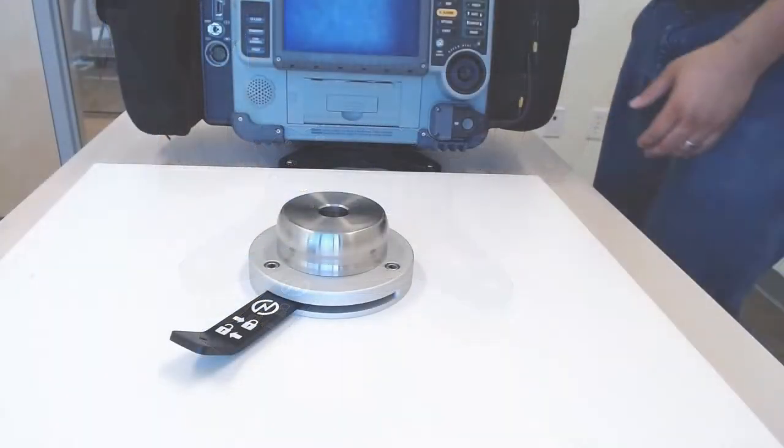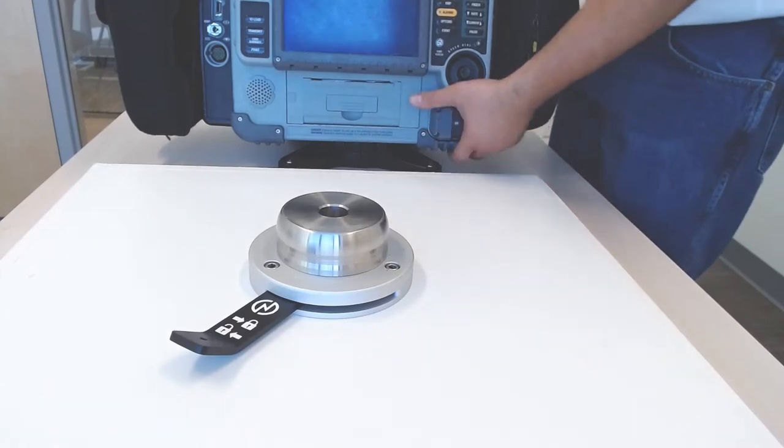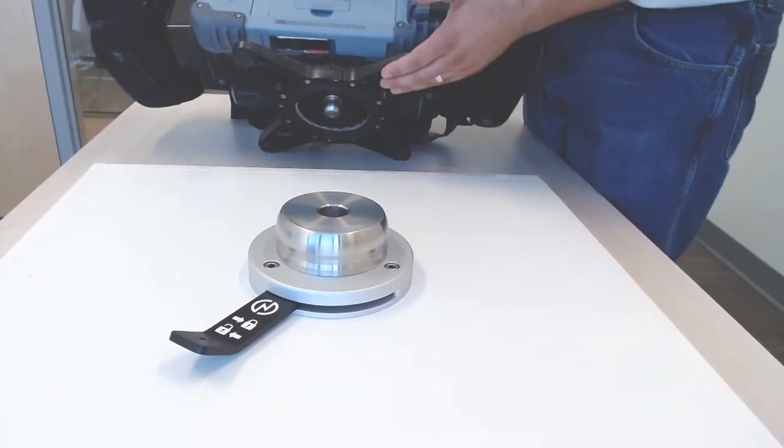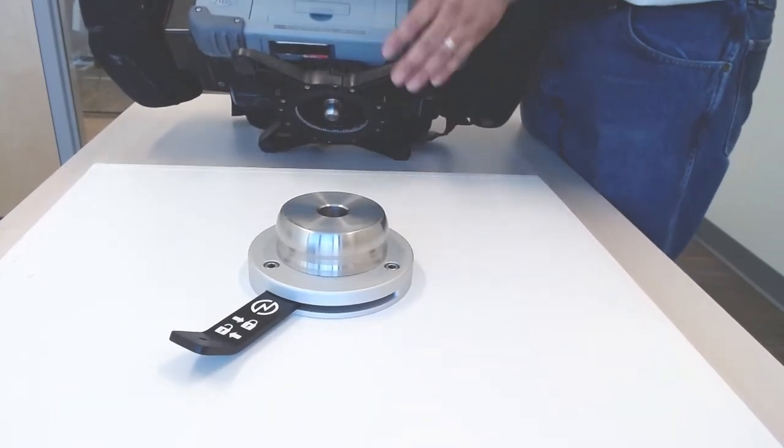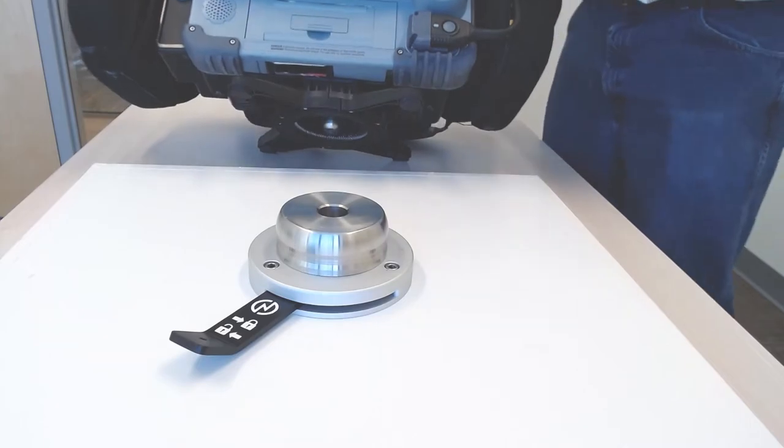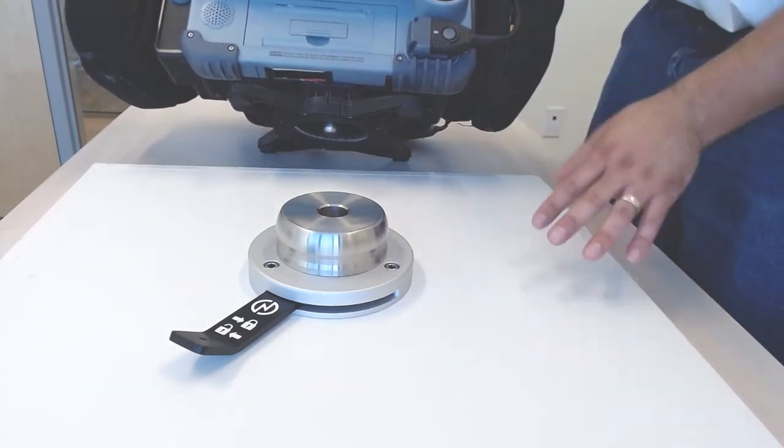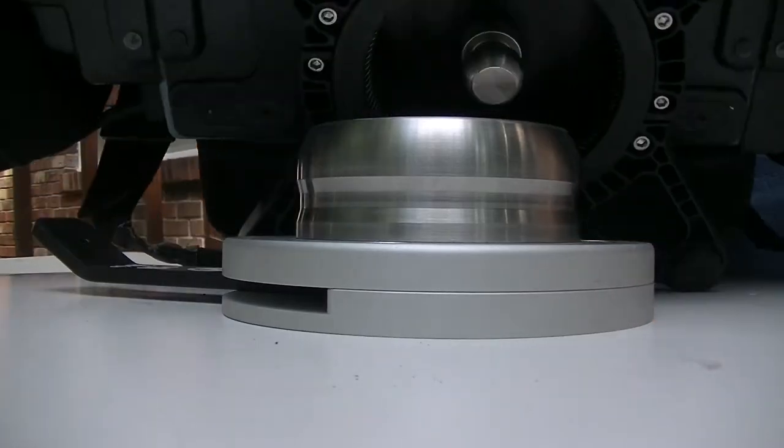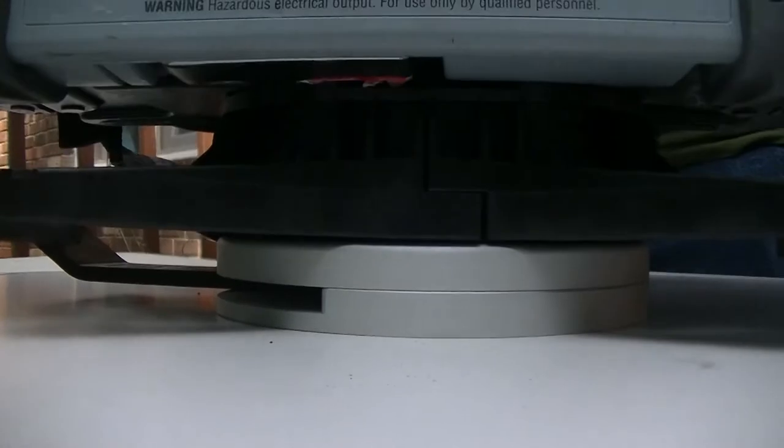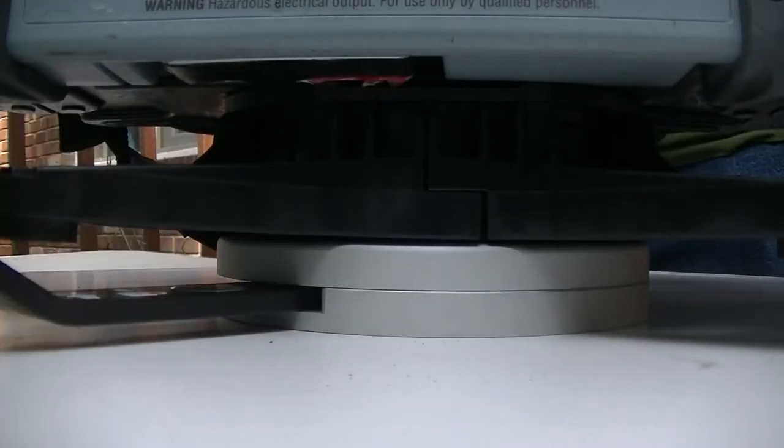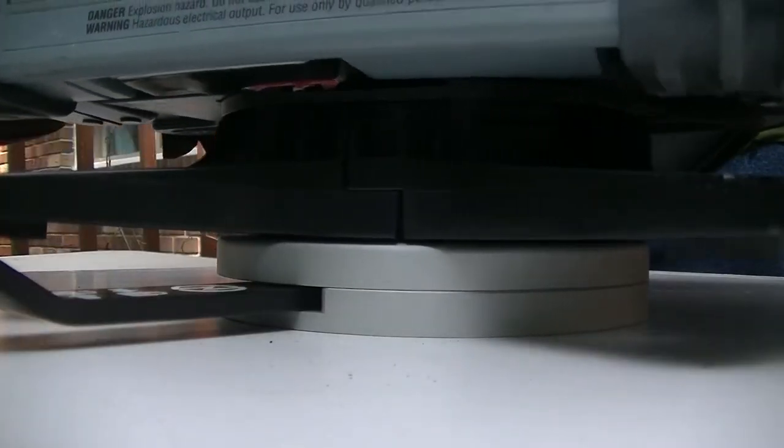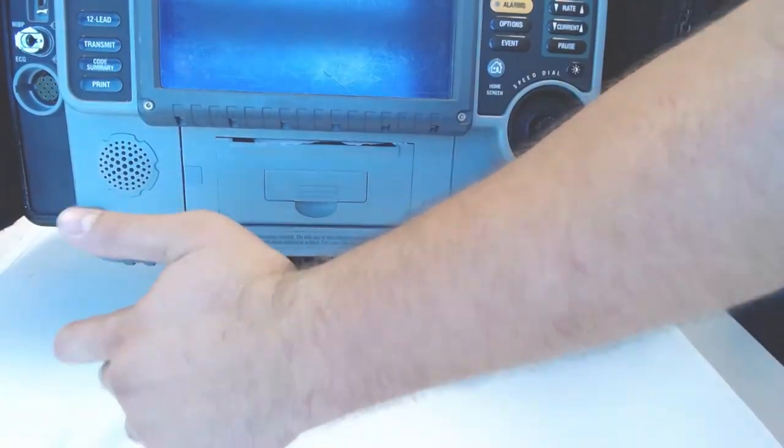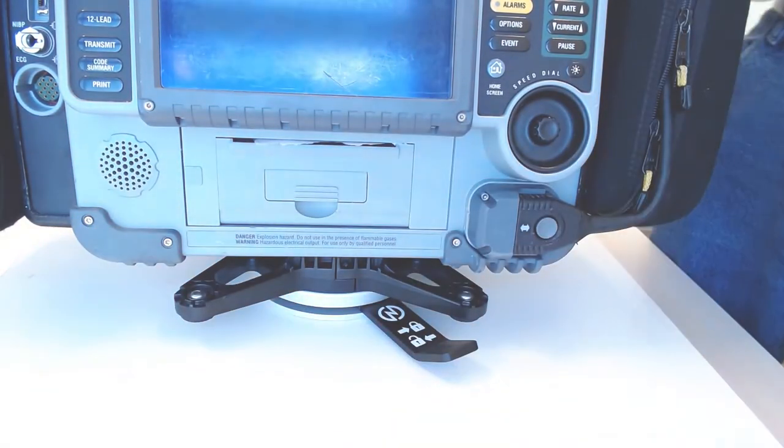With the Snap Adapter securely mounted to the bottom of your LifePack unit, you're ready to use your Snap Mounting System. Simply set it down on top of the adapter, the mounting base, and touch with the finger to lock.